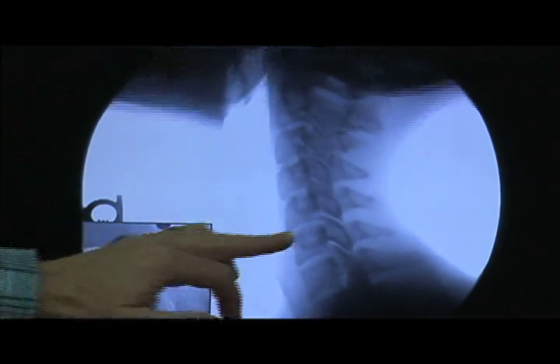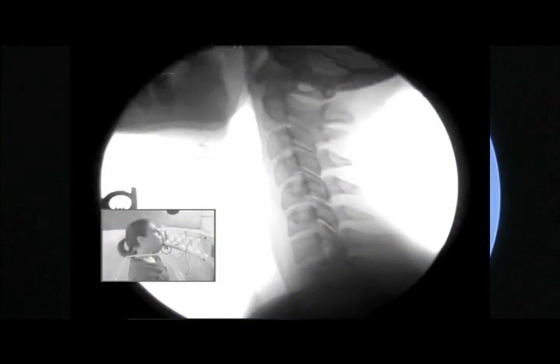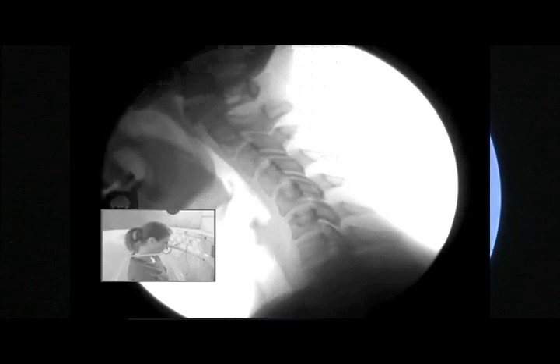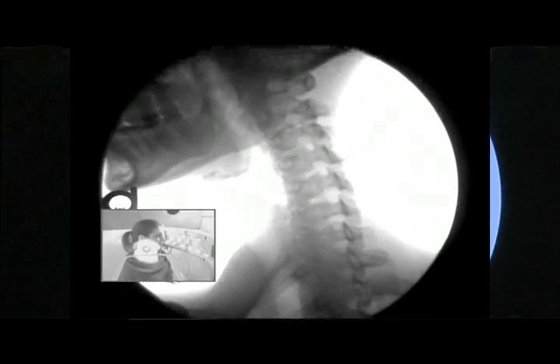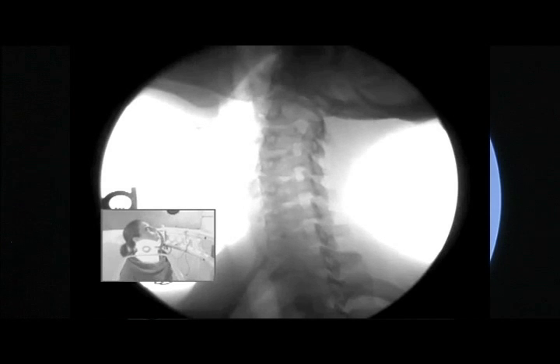The posterior part, or the back of the neck, is where the joints are. That line is the joint of a knuckle joint, like your thumb, in the back of the neck. And each spinal bone has 4 of them. One with the bone above, one with the bone below, and on a left and a right side. So there's 4 knuckle joints to each vertebra.